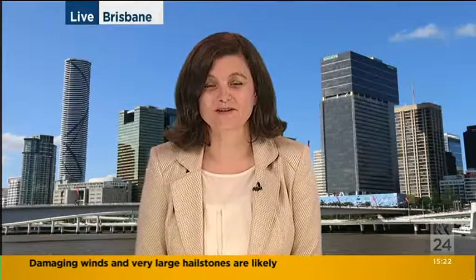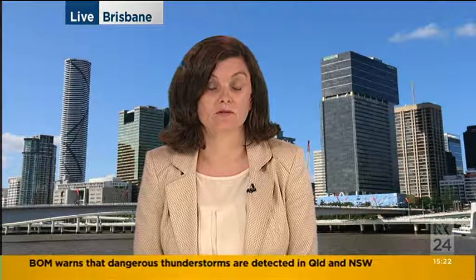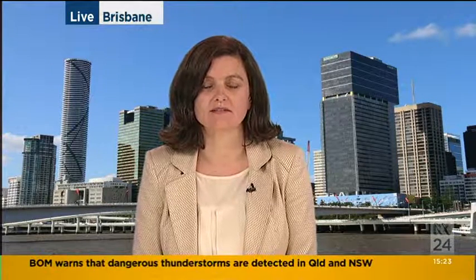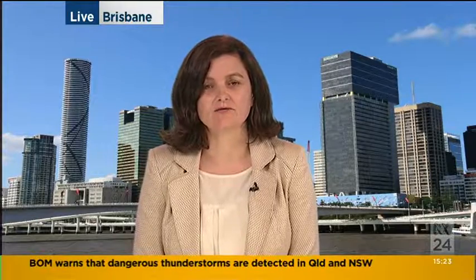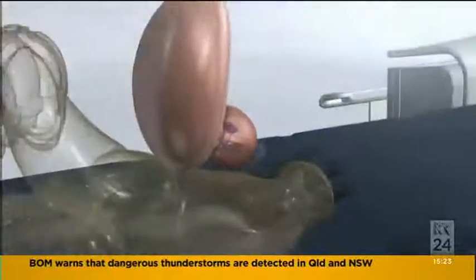Thank you, Catherine, for having me on the last day of November, Prostate Cancer Awareness Month, to talk about radiation. So it's like a GPS tracking system for the prostate. A little bit like when you're in your car and the GPS can track you within a few metres, this system tracks the prostate within 1 millimetre of where it is. And it utilises 3 small beacons that are inserted into the prostate when the patient is asleep.